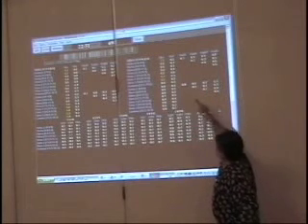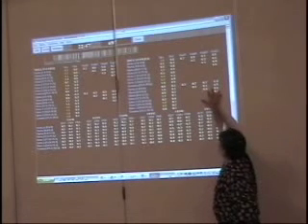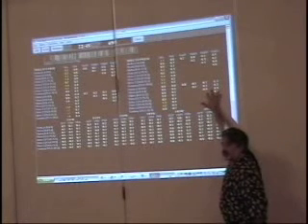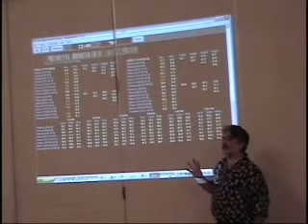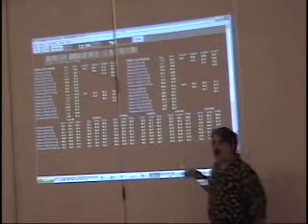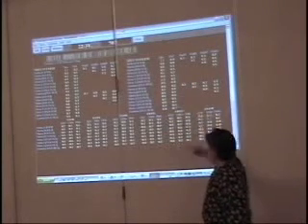For each channel, we have 8 absolute powers, 8 relative powers, and 10 power ratios. That's 26 numbers. So we have 26 numbers 4 times. Those are the power or amplitude-based numbers. We have it for F3, F4, P3, and P4.